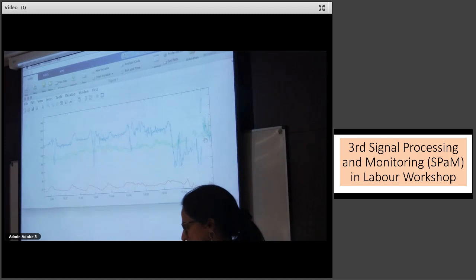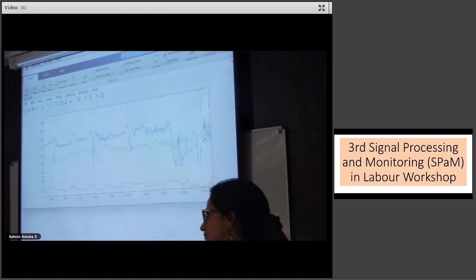And you're not going to see that with an external monitor. You can infer it from coupling of contractions.